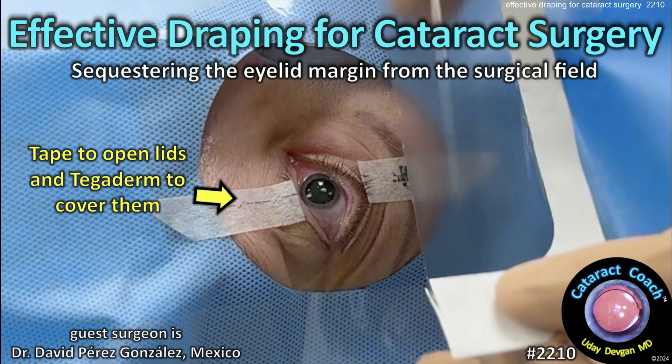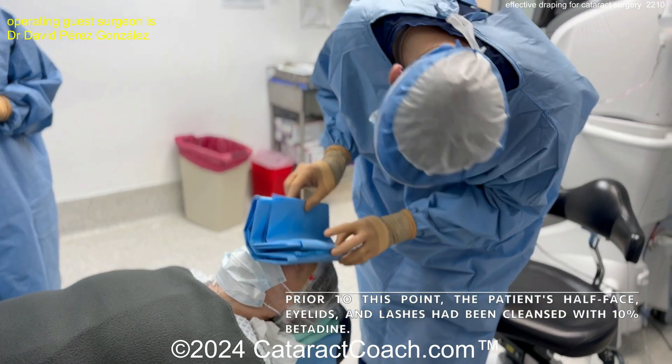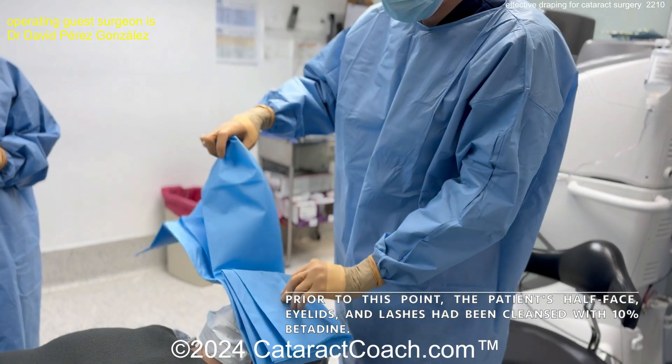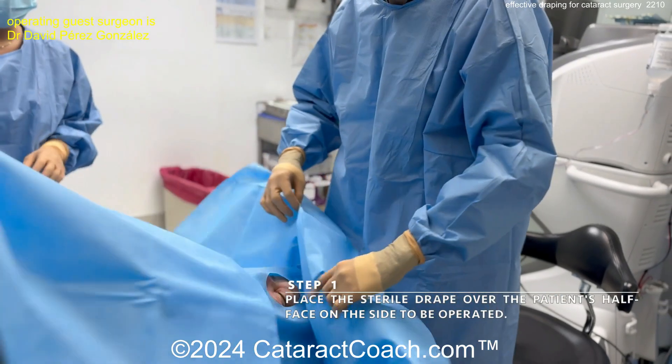CataractCoach.com presents effective draping for cataract surgery, sequestering the eyelid margin from the surgical field. Our guest surgeon sent in this video showing how he likes to do the draping. The patient's face, eyelids, and lashes have been cleaned with 10% betadine, and that looks great. He's placing sticky drapes over the patient.